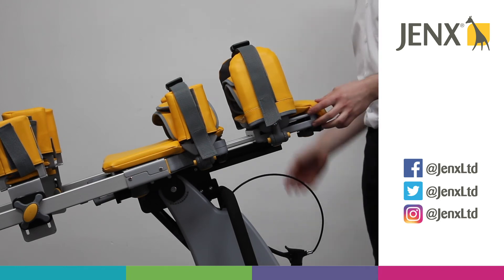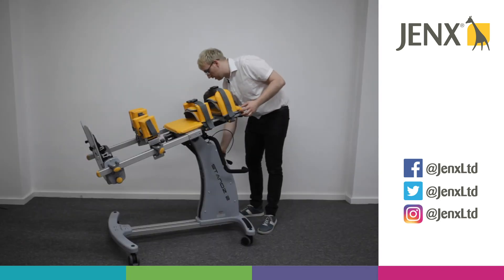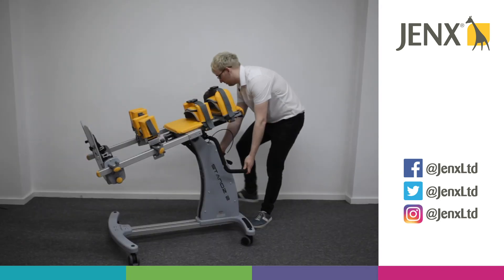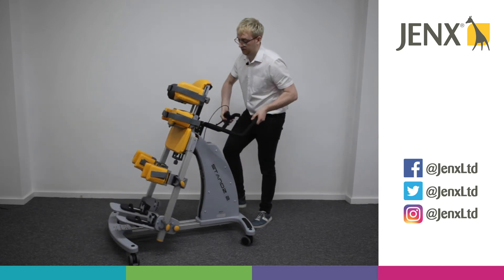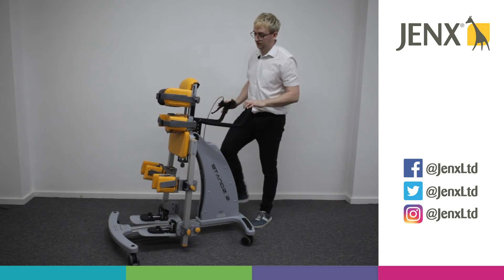When we're ready to come up, we again release the lock and press the handle. Place one foot on the frame itself and we can lift the frame up.